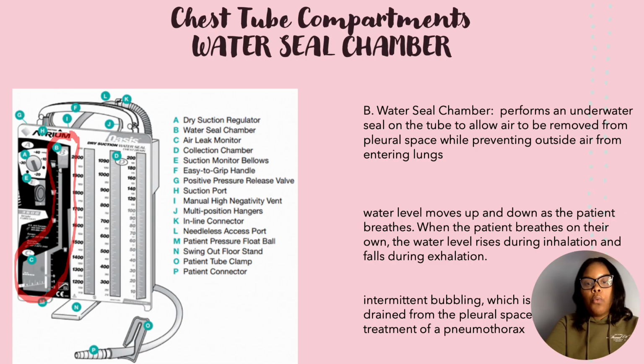In your water seal chamber, after we fill it up with water, there's going to be a little ball that sits right down here. What are we going to be looking for in our water seal chamber? It's going to be a little ball in this little skinny part. I like to say there's a skinny part of our water seal chamber, and there's our big old wide part right there.